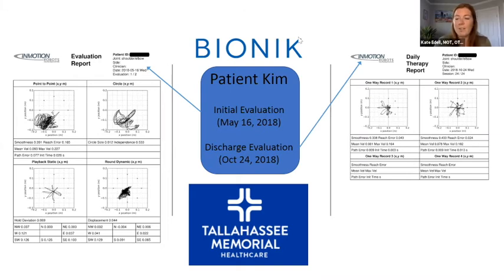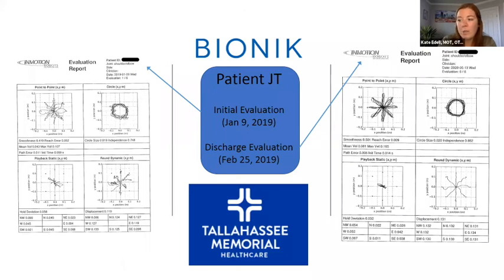Great points. Yeah, her goals specifically were feeding and driving her wheelchair independently. That's great. Okay, now we have even one more patient example for this next question. It asks if you could explain how you incorporate the InMotion ARM into your clinical practice and talk about specific diagnostic groups that you tend to use the device with.